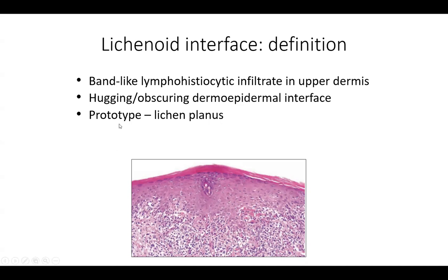The prototype for lichenoid interface is lichen planus. This picture could be lichen planus: you have hyperorthokeratosis overlying it, a wedge-shaped hypergranulosis, some sawtooth rete ridges, and a nice dense band-like lymphocytic infiltrate.